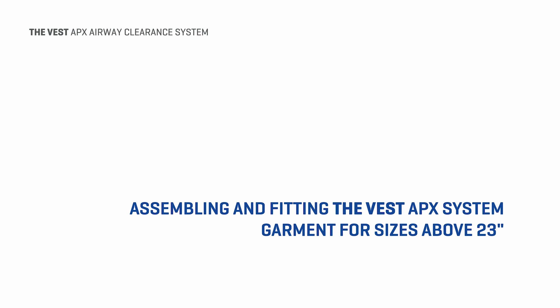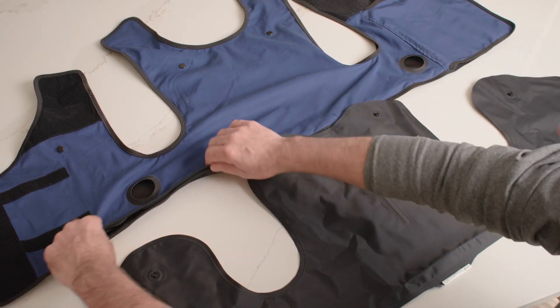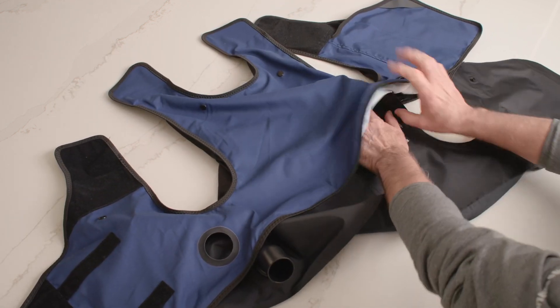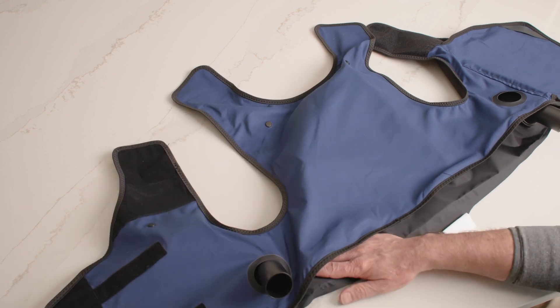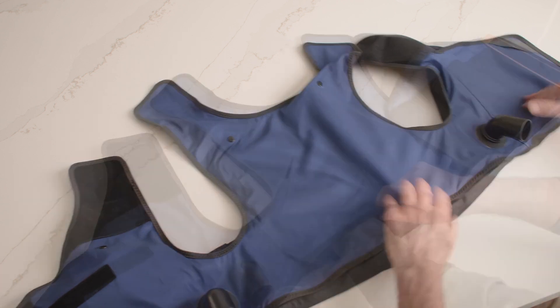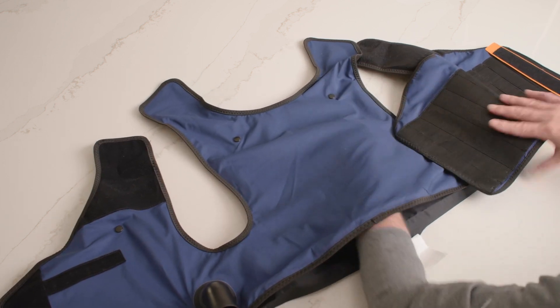The Vest APX system garment will be shipped to you in two pieces. Follow these steps to assemble the vest garment for sizes above 23 inches. Place the outer garment and the inflatable bladder on a flat surface. Unzip and open the bottom of the outer garment. Slide the inflatable bladder into the outer garment. Be sure you push the edges of the bladder out so it lies completely flat inside the garment. Put the air hose ports on the bladder through the air hose port openings of the garment and make sure they are held securely in place. Press the six snap-on buttons to attach the bladder to the garment, and close the zipper.